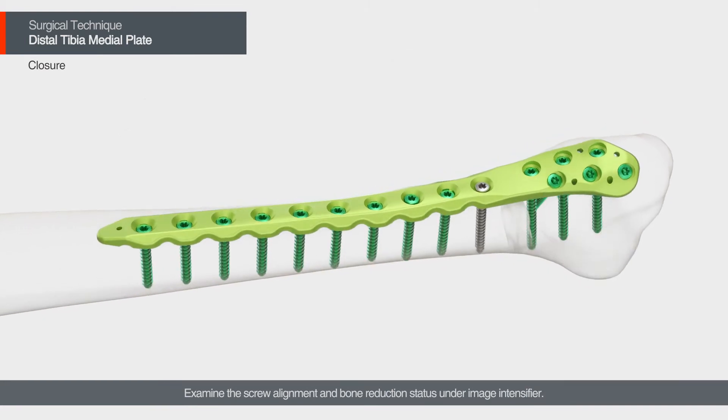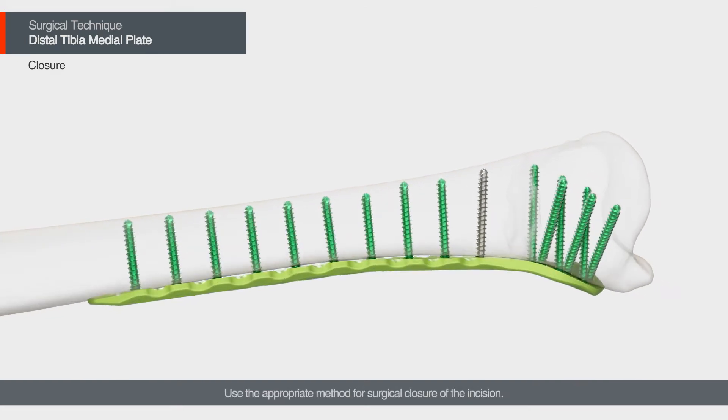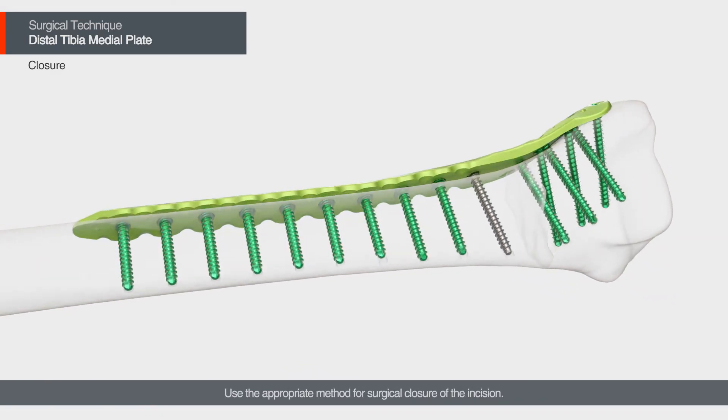Examine the screw alignment and bone reduction status under the image intensifier. Use the appropriate method for surgical closure of the incision.